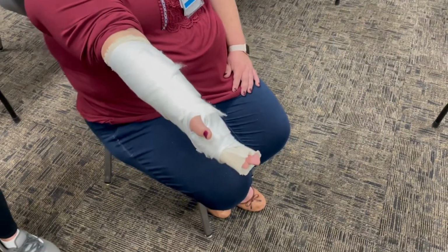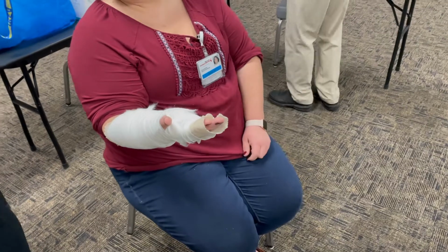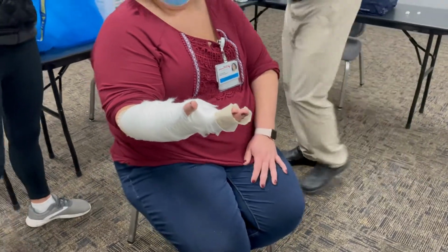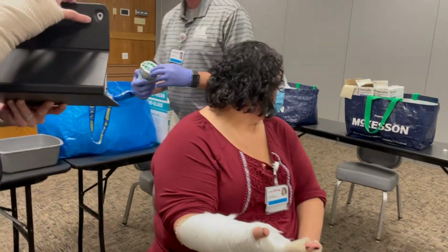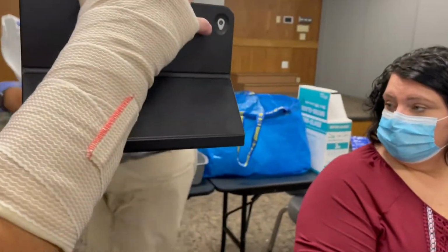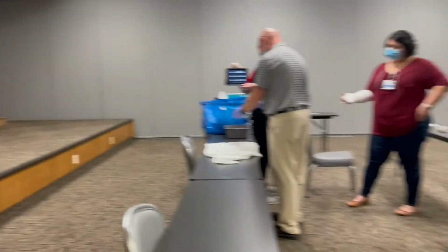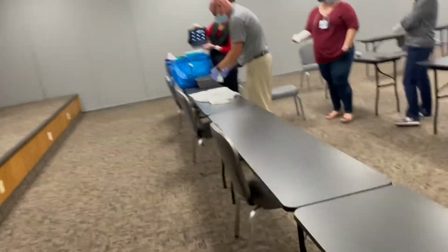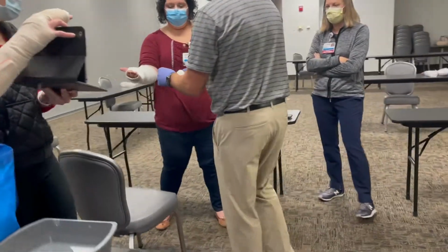All right, so now we're going to do our plaster. So she can just relax. Now we're going to do this part. I'm going to do my plaster roll. So we'll come over here on the table and show this. This is a roll plaster. This is 3-inch. I'm going to do it over a towel because it's really messy. And I'm just going to go over here and measure on her how long I want it.